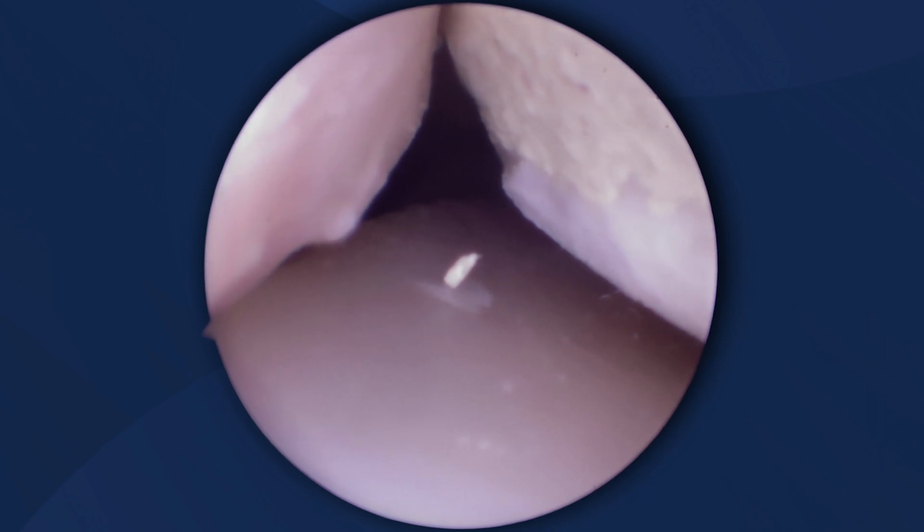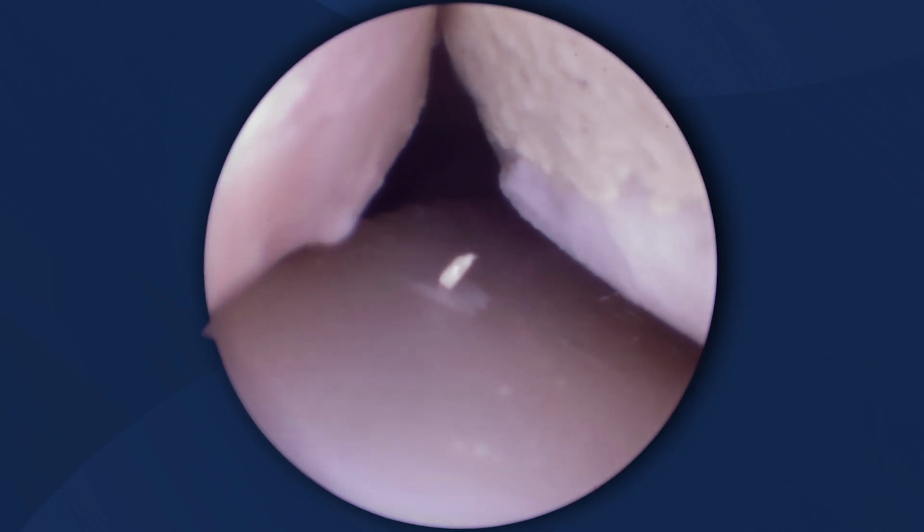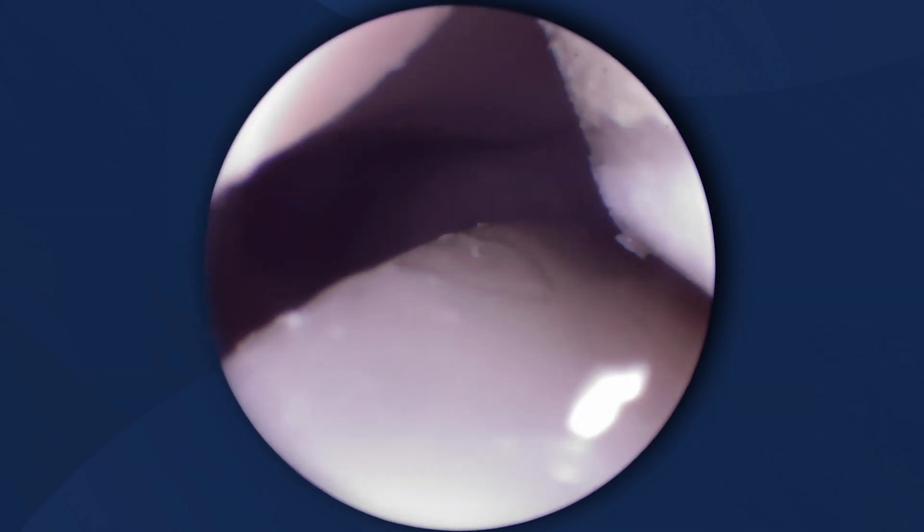As we go into the posterior aspect of the knee, the septum is to the left of the screen, the meniscus is on the bottom, and I see the bony cartilage interface on the top right. You can see the relationship of the meniscus to the cartilage, and we've sequentially released part of the PCL. You can see how we can obtain more of a drawer, and the mechanics of the knee will be restored when we put the meniscus back to hugging the cartilage surface.